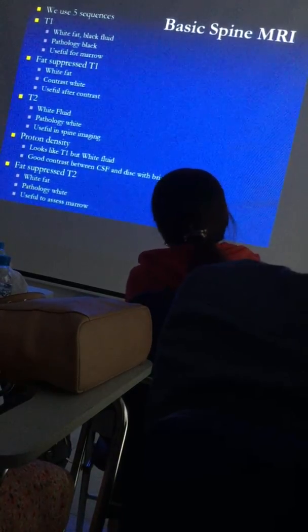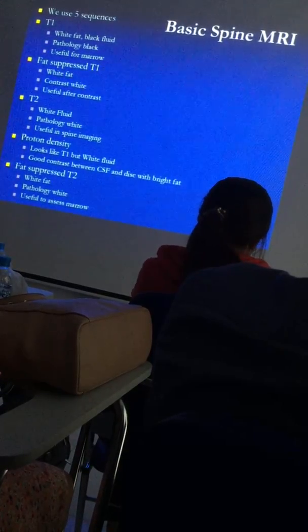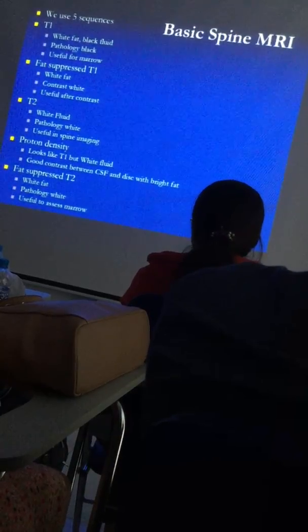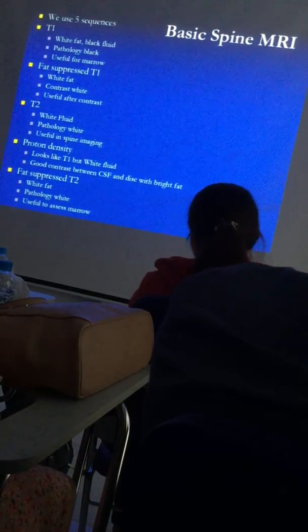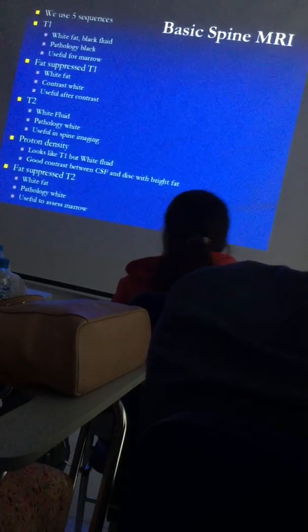Yeah, so we use the fat T2s for trauma too. So if you're looking for whether you've had an anterior longitudinal ligament injury or an interspinous ligament injury, you only really see that on the fat T2. So we look at this for trauma and infection and for tumour.